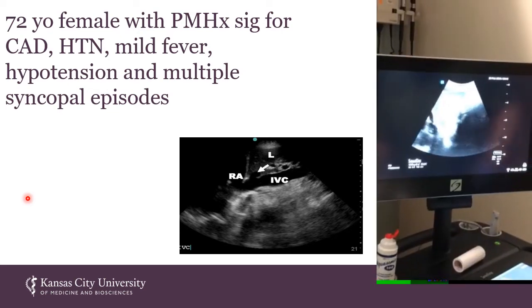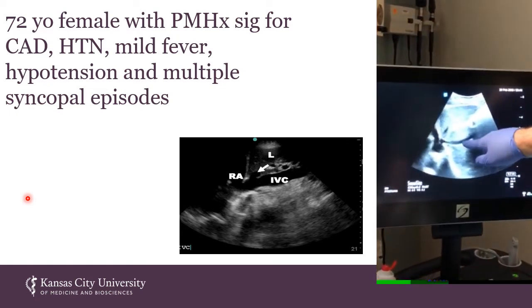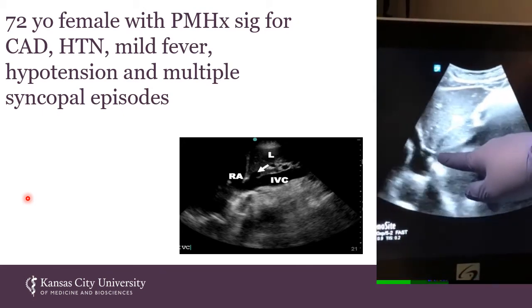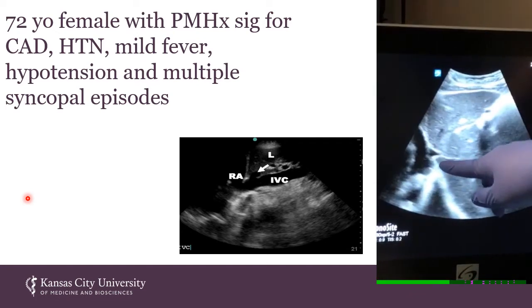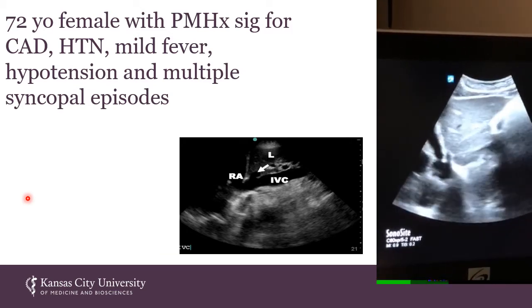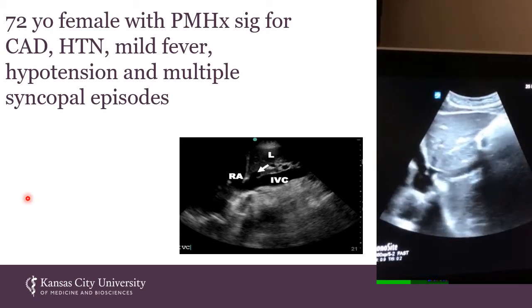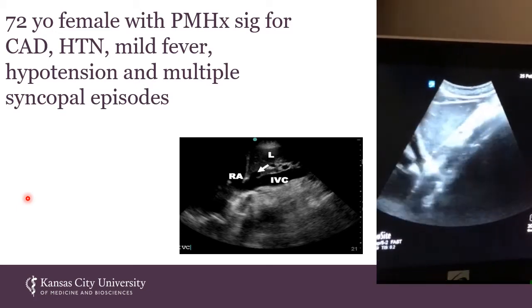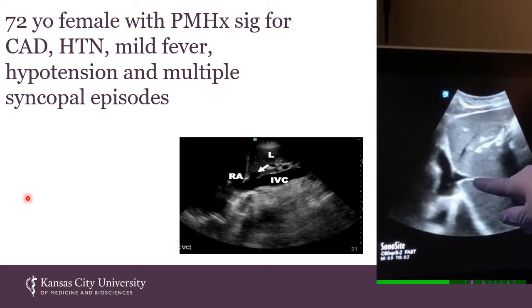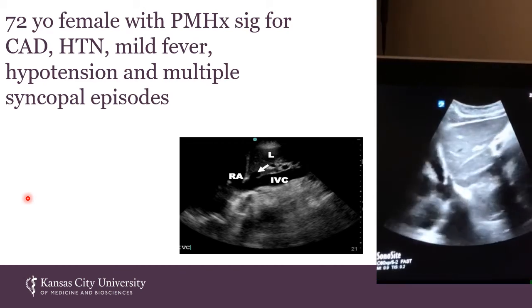Now, I don't know the etiology of why your central venous pressure is low, but typically if the heart has a good squeeze, there's no evidence of tamponade, and the IVC is low, then you think about things that would cause that. Decreased volume from blood loss or dehydration, or decreased systemic vascular resistance from overdose of medications or over medication of blood pressure medicines, or from possible sepsis. And in this lady, she actually had a urinary tract infection and was mildly septic secondary to that, and mildly dehydrated as well. So that was the etiology of the shock, and that's how we use it, much like a stethoscope, to help us determine the cause of the patient's shock.